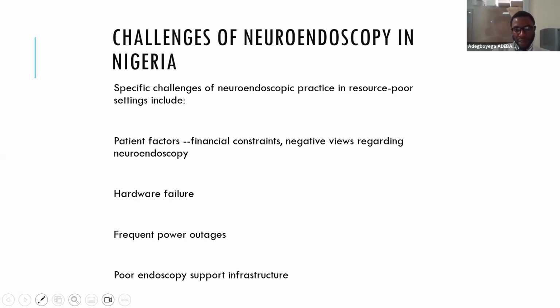Hardware failure as a result of frequent power outages, poor handling, and storage of neuroendoscopic equipment is also a problem. Additionally, poor endoscopy support infrastructure is a significant problem of neuroendoscopy practice in Nigeria.